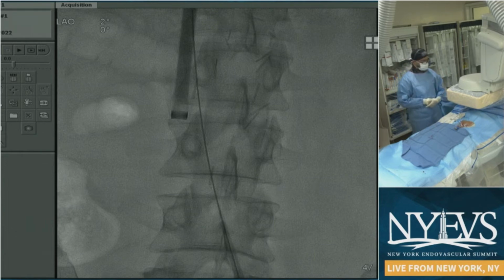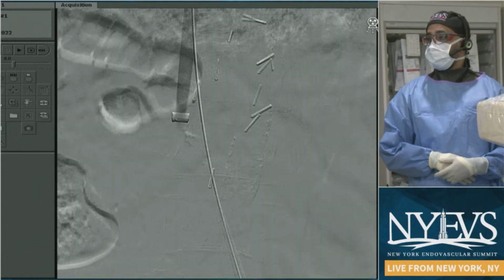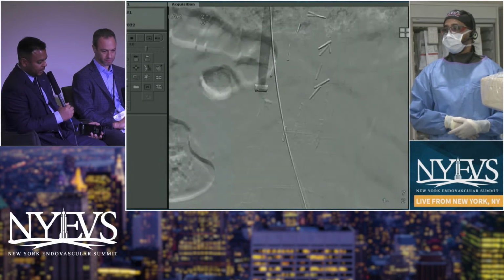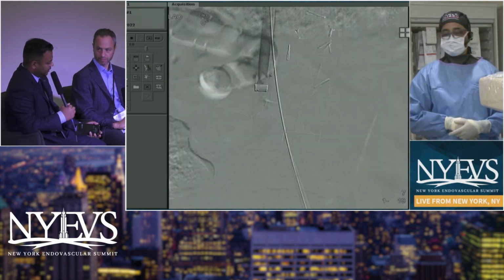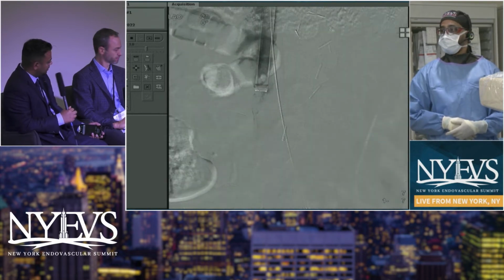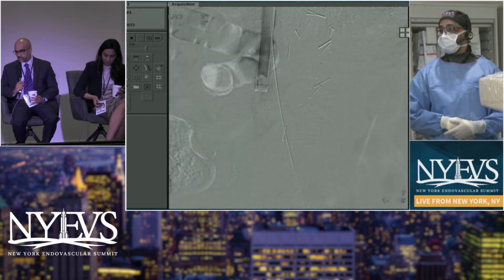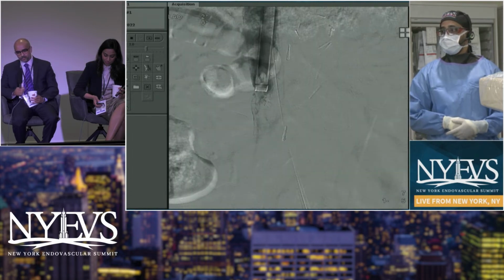I don't know, Kush and you guys, if you're doing the same thing. Yeah, it really depends on how the imaging looks beforehand. With this, if it's a significant amount of forceps work, I agree. At least MAC anesthesia, and then depending upon patient factors, general anesthesia. If I'm going to invert something, then general anesthesia for sure. Yeah, I agree. The Lumal forceps can be painful for these patients when you're torquing it in the back, so it's helpful to not have them awake for that.